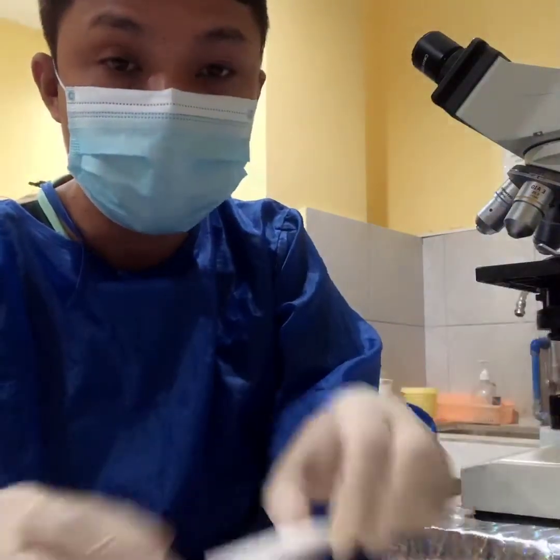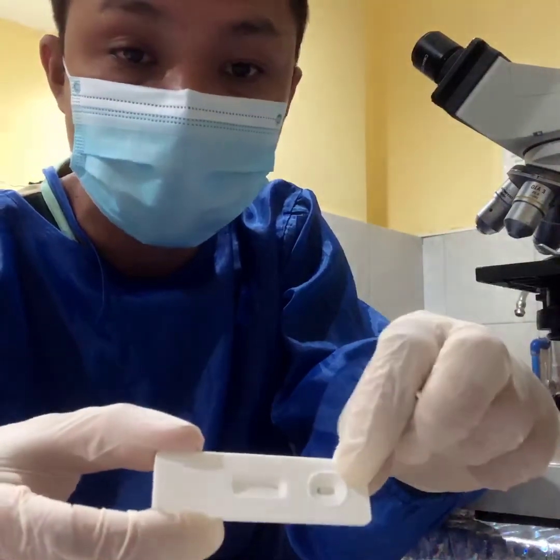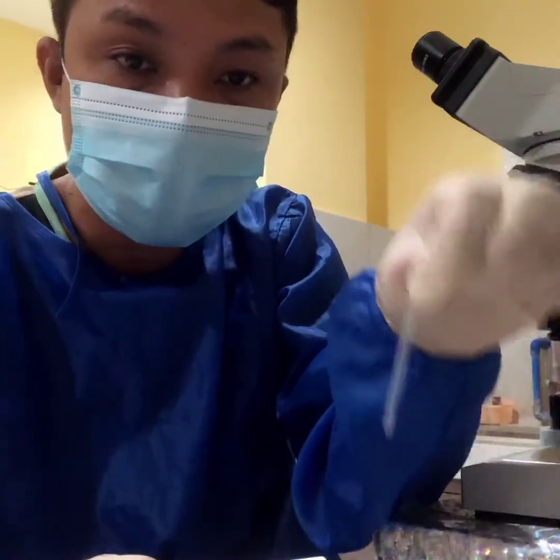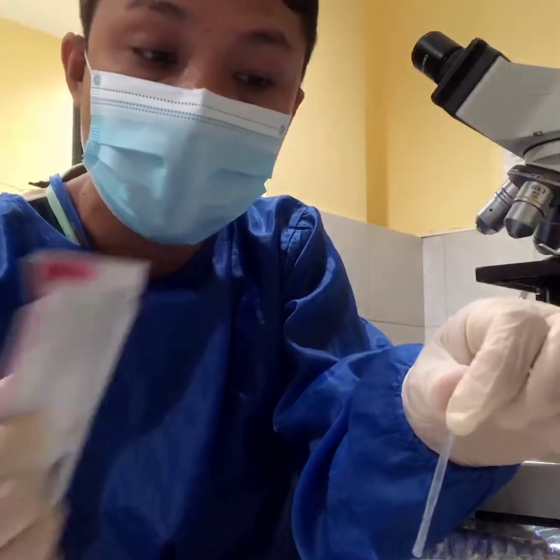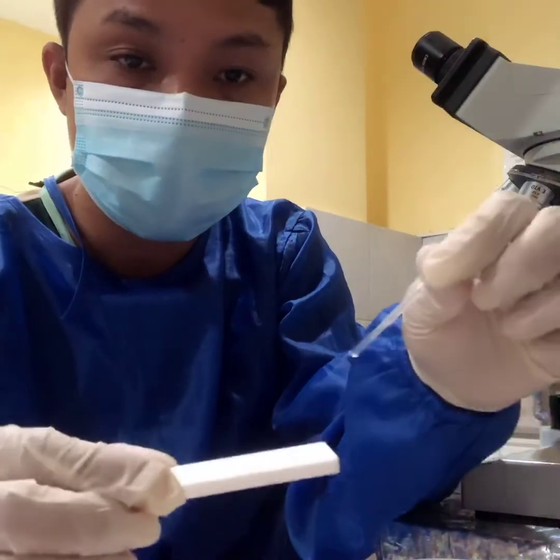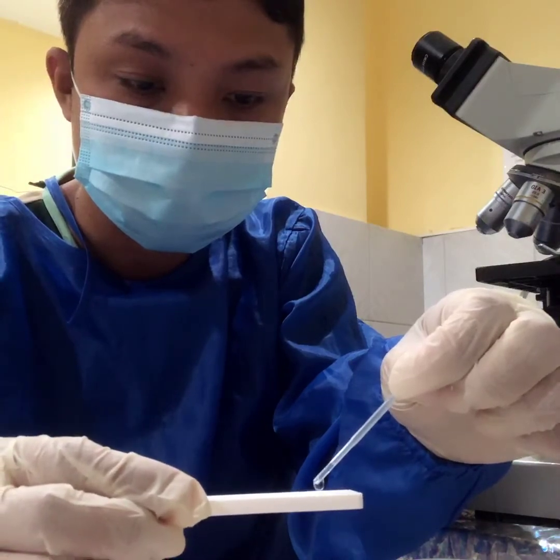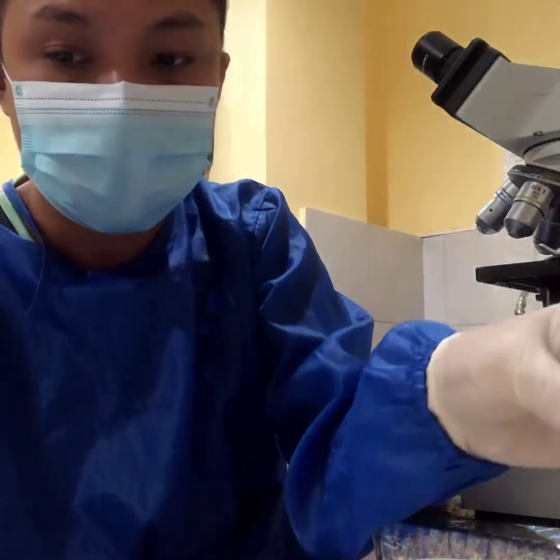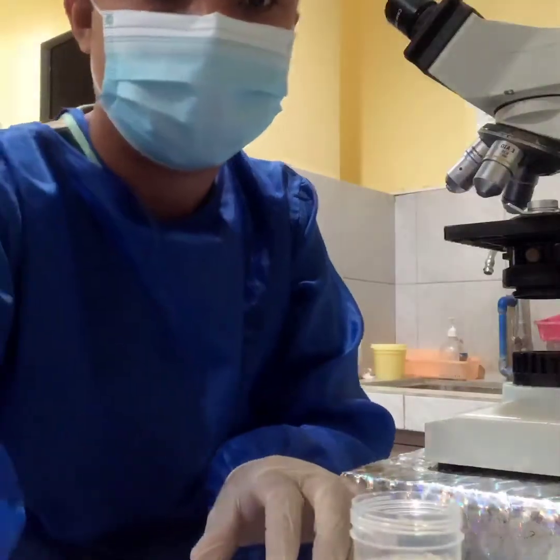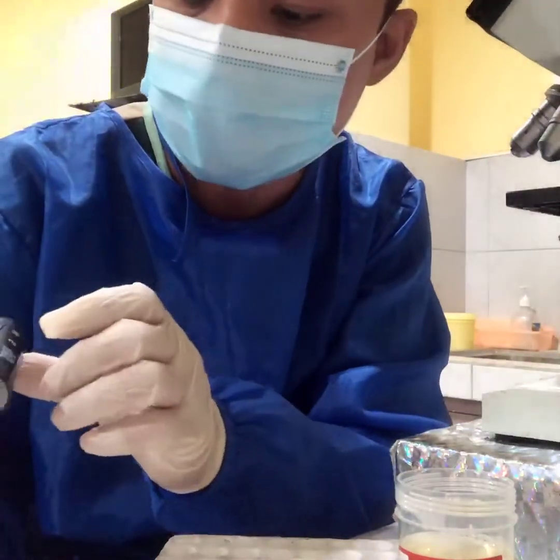Again, for the procedure, we have the sample well where you're going to add your sample. Just add 2 to 3 drops. We also have the pouch with the dropper already included. Then start the timer, and wait for up to 5 minutes.